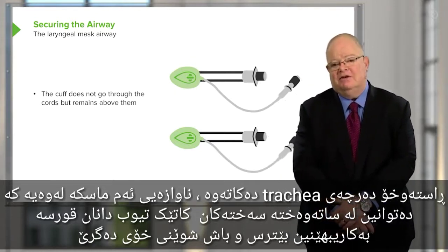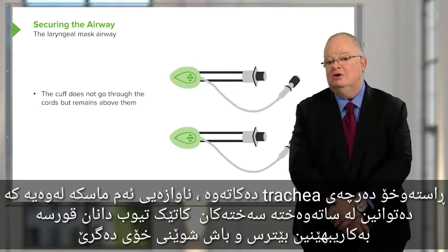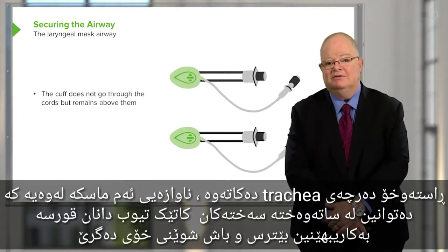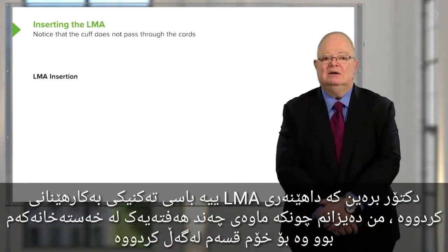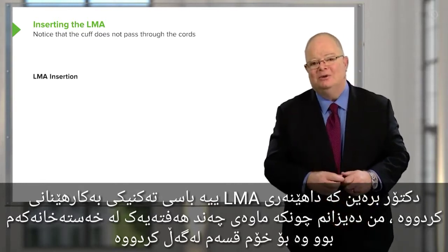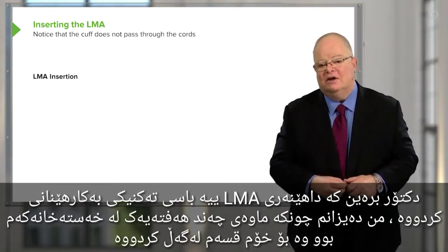The beauty of this device is that even when it's not perfectly positioned, it's often usable. And you can get out of a lot of trouble using this device, even in situations where you're having great difficulty with intubation. This is how it works. Dr. Brain, who invented this device, recommends the following technique, and I know because he was in my hospital for a number of weeks and taught myself and my colleagues how to use this.